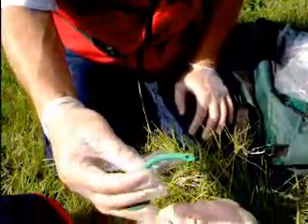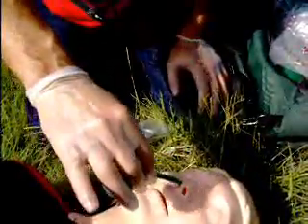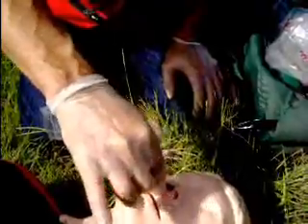There is an angle of opening on this, and you want this pointed towards the center. So we have to go into the right nostril with this airway. If you needed to do a left nostril for some reason, you would take your scissors and cut it the other direction.